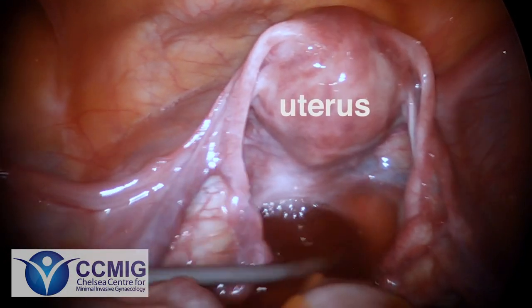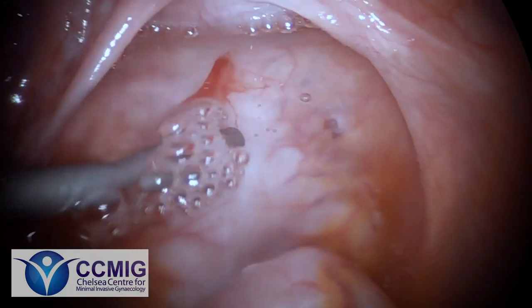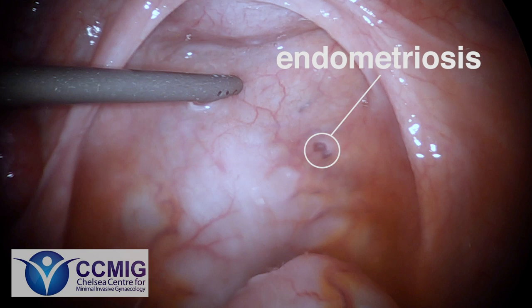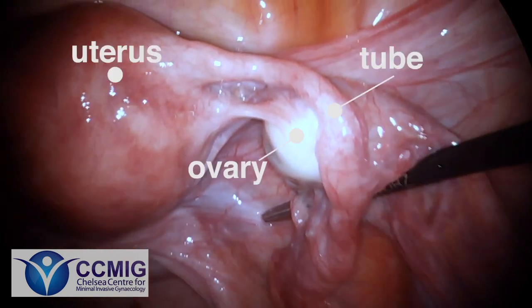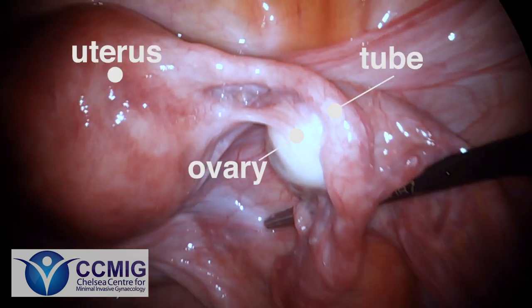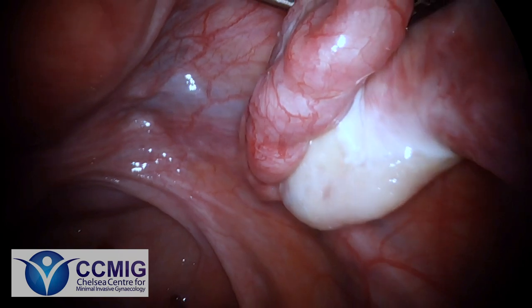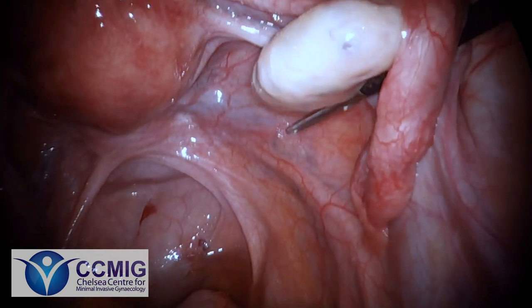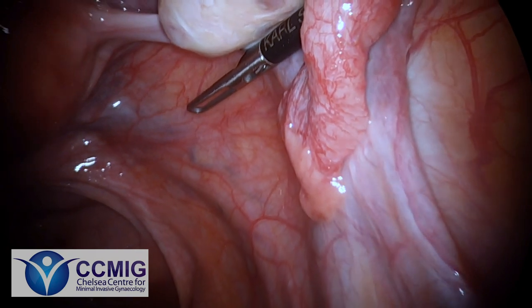A little bit of cleaning and suction allows us to clearly visualise everything, and going down into the pelvis we can see on the right hand side that patch of endometriosis. This looks like quite superficial endometriosis just involving the peritoneum. Here we're looking at the fallopian tube and ovary on the right hand side, the uterus there on the left. The fallopian tube moves freely around the ovary and is constantly wafting around — this end of the fallopian tube is where the eggs travel down before conception happening deeper down in the fallopian tube. In endometriosis occasionally these structures are all very scarred and stuck together, and it's one of the causes of subfertility.